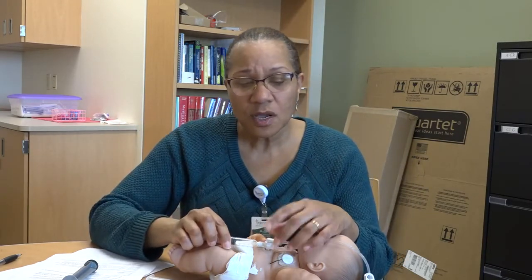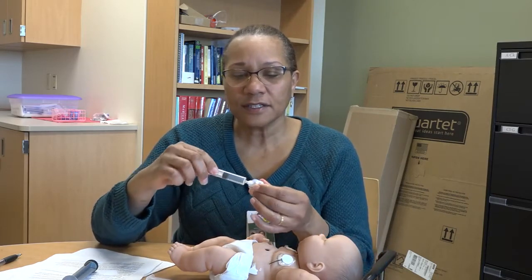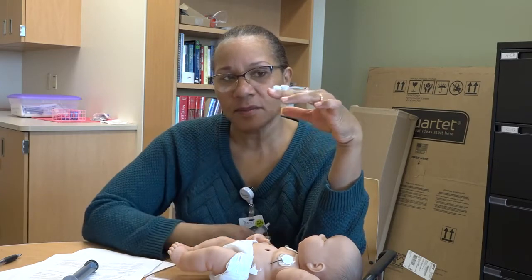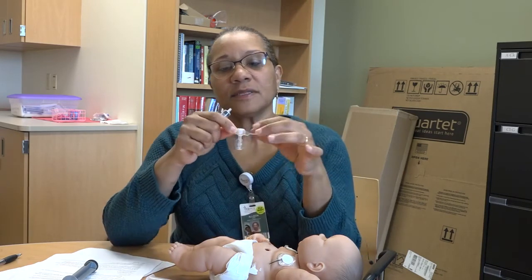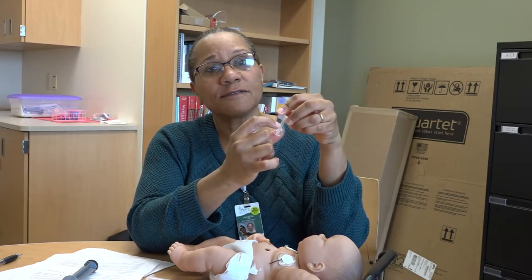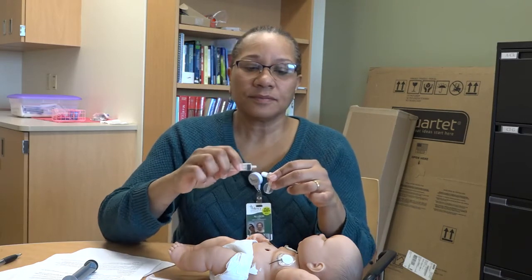Okay. So what are some causes of leakage, and how do we address those things? So one of the causes of leakage has to do with the volume of water in the balloon. As I explained to you earlier, there's about 5 cc's of water, 5 milliliters of water in the balloon. That's what causes the balloon to sit up against the stomach wall, and it does decrease leakage. Okay. Sometimes you may find that instead of just seeing that small amount of the white line, you're noticing that the balloon is fitting more loosely, and maybe you're even seeing more of the white line than you were seeing before.